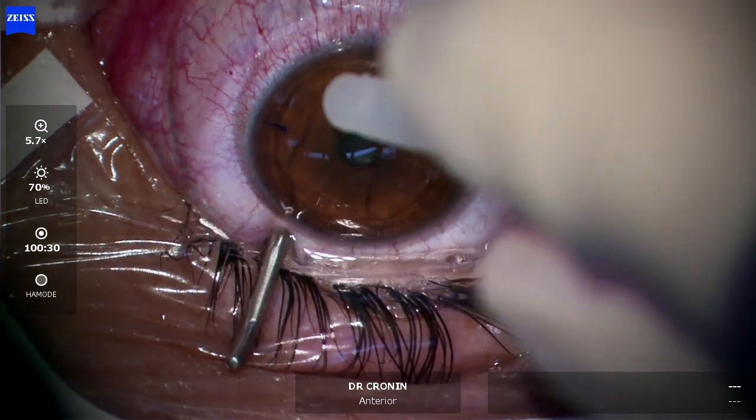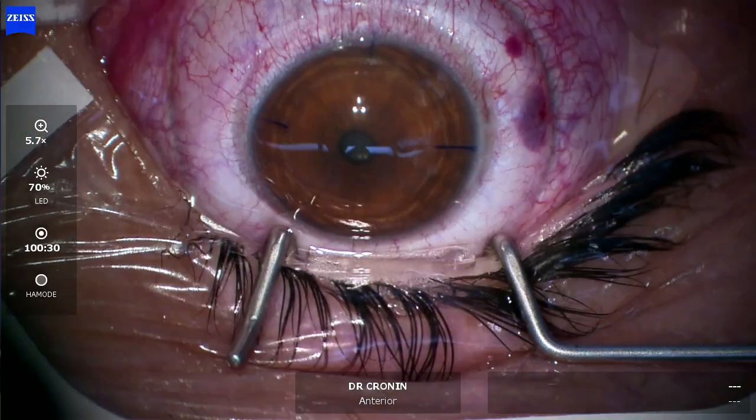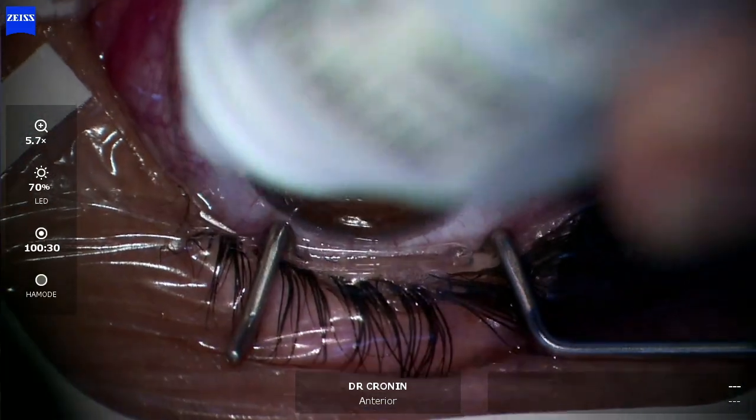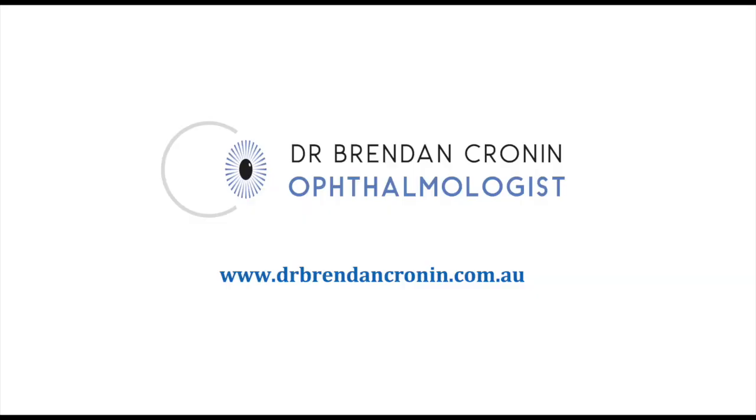Some drops on the eye. It takes these patients about 48 hours for their vision to really clear, but it's an excellent flapless procedure for refractive surgery correction.